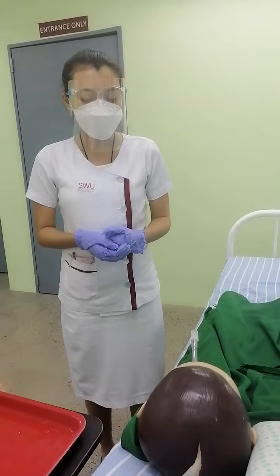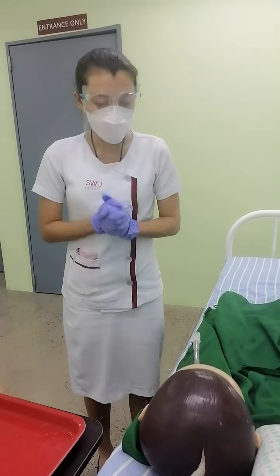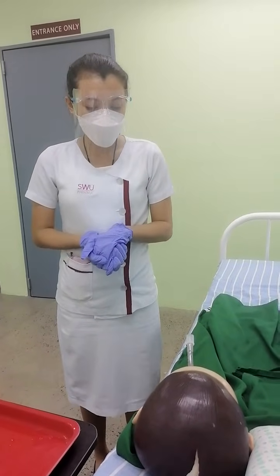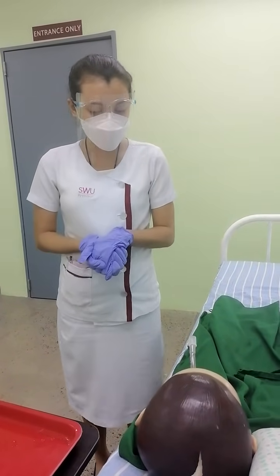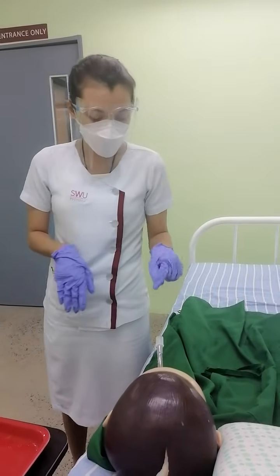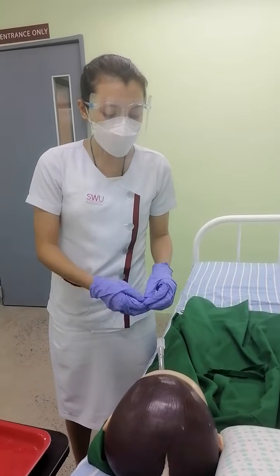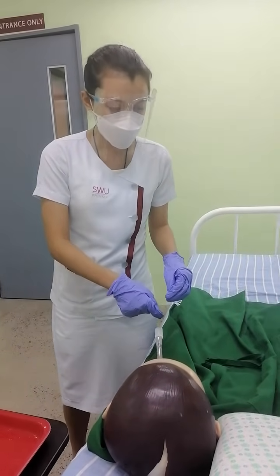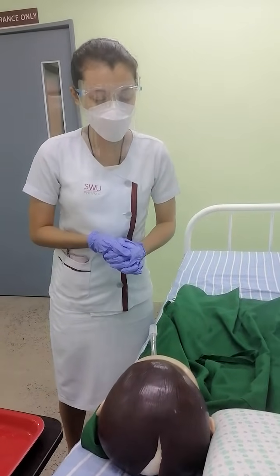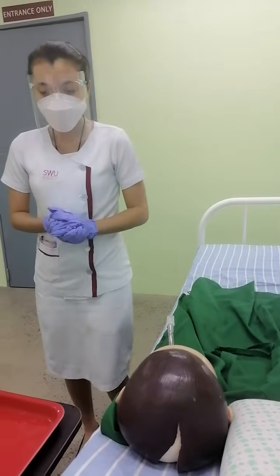Explaining the procedure also promotes comfortability and trust to the healthcare worker. Good afternoon, I am your nurse for today, and I will be suctioning your endotracheal tube. I will be inserting a catheter into your tube that is inserted into your mouth, and it will guide me into the trachea in order to suction all the secretions in your lungs. This will also help you improve your respiratory status.